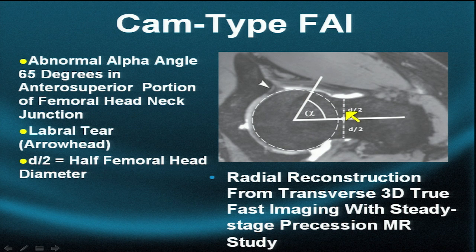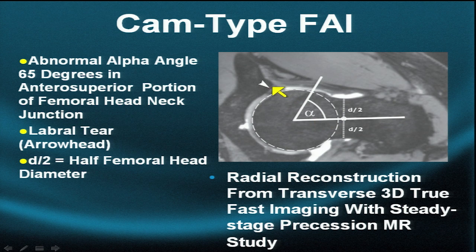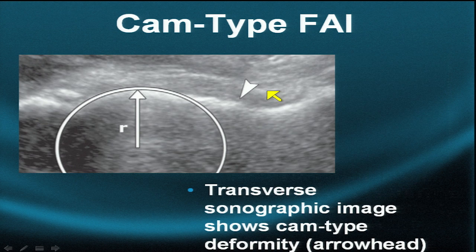D divided by two and D divided by two should be equal to correctly draw this line. Our patient has a through-and-through labral tear without a paralabral cyst.